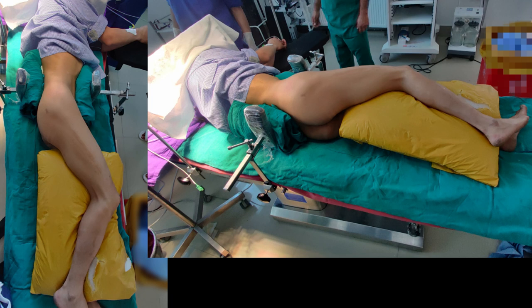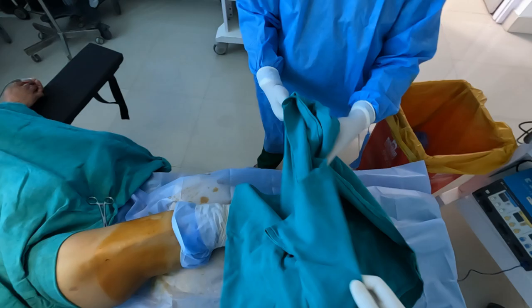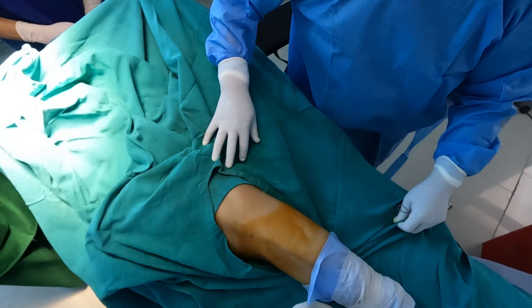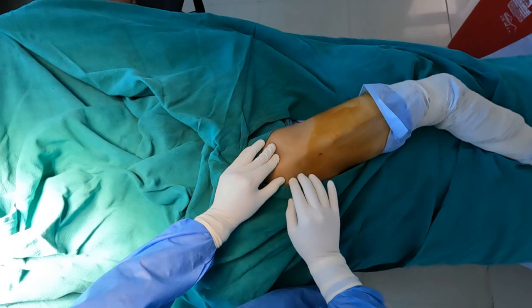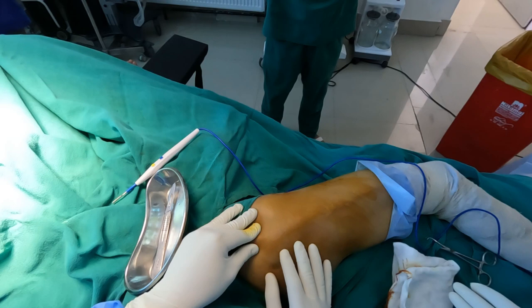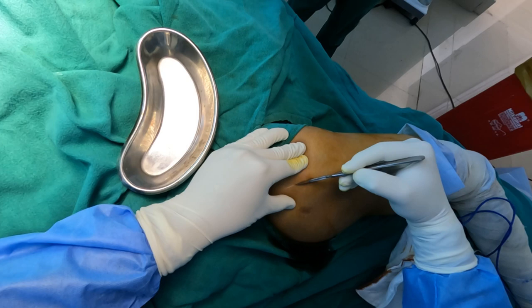The patient was taken for surgery and kept in the left lateral position. After thoroughly painting and draping the patient, the knee is flexed and one palpates the trochanteric tip. As you can see, with my fingers I am trying to locate the trochanteric tip, and a curved incision is made along the trochanteric tip.